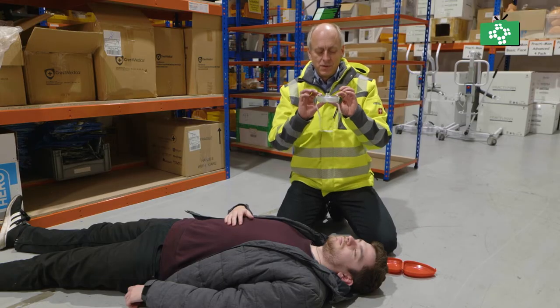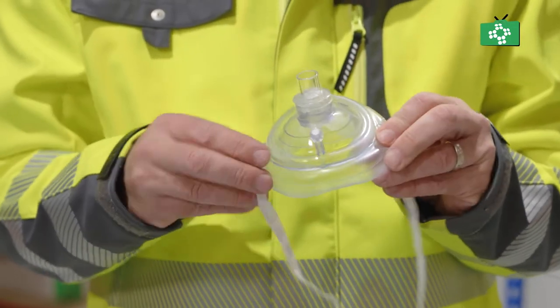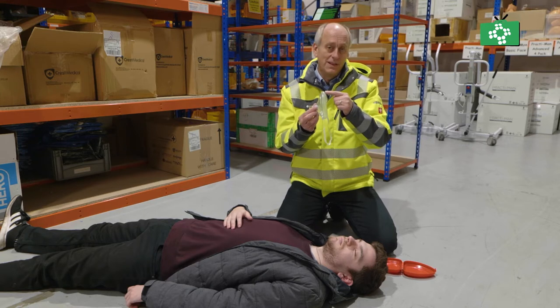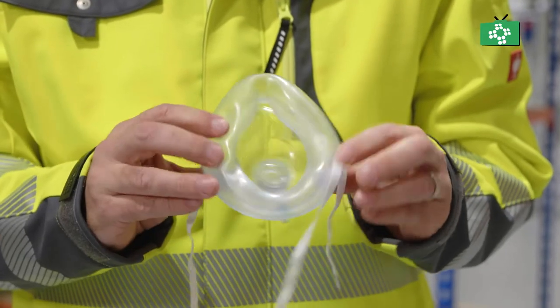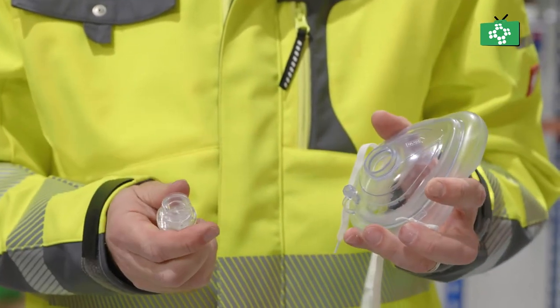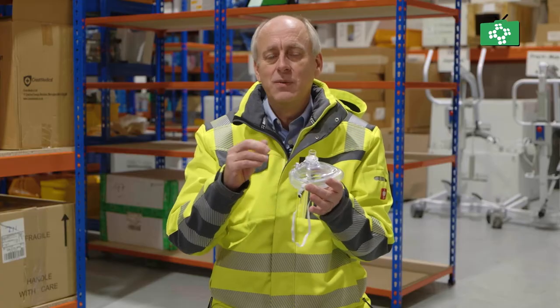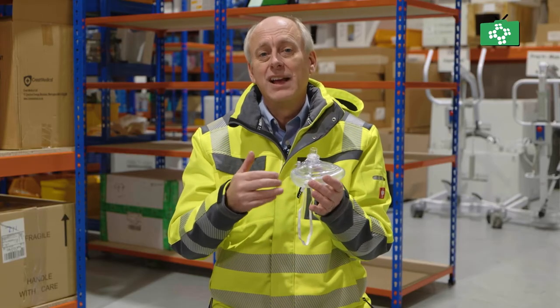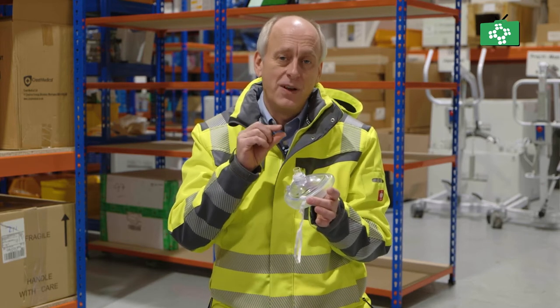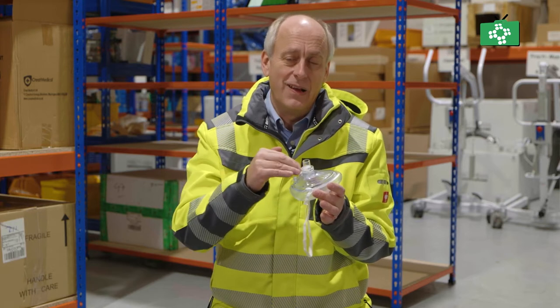They're always squashed quite flat for storage, so all you need to do is push it into this shape. What you've got in the pocket mask is the section at the top where the nose goes, and the mouth goes on here. On this side you've got a one-way valve. An advantage of this is your mouth is that much away from the patient's mouth, so if there were any body fluids or vomit you're a long way from them, and there is filter paper in there to provide filtration between the breaths going in.